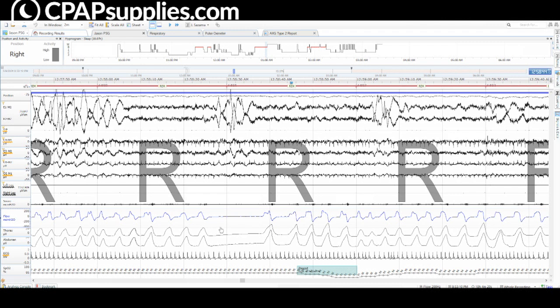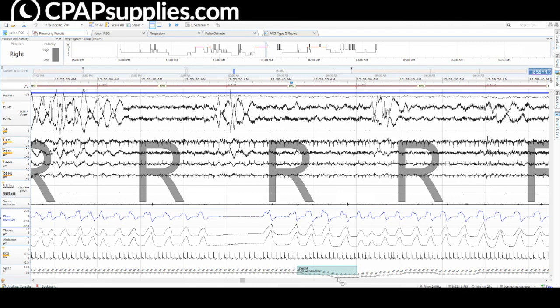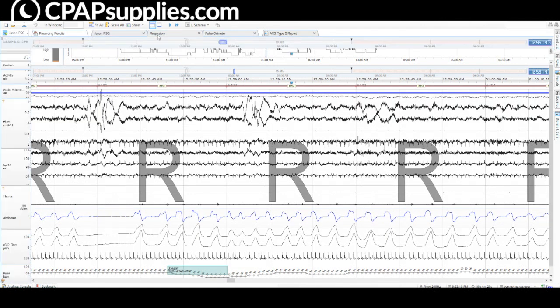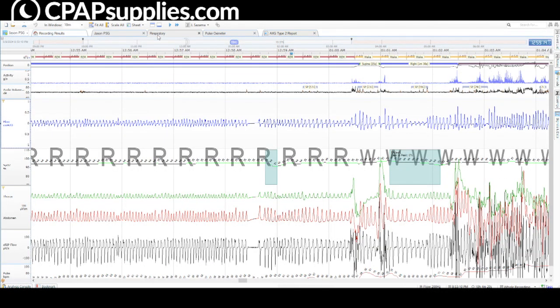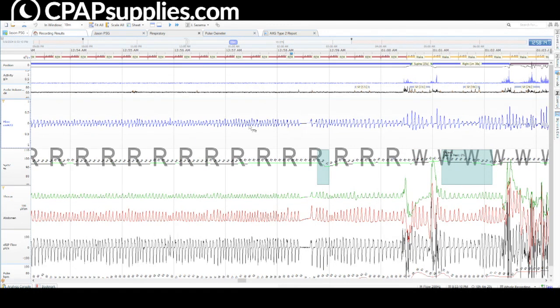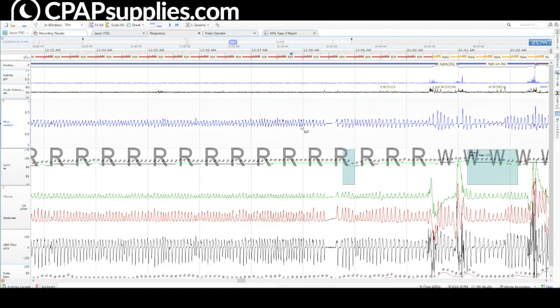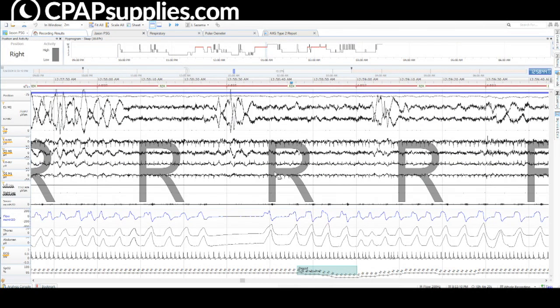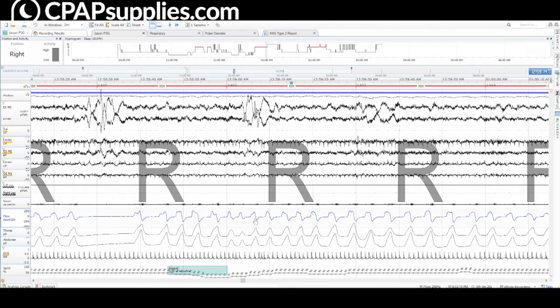Yeah, I probably should have scored it. But anytime you score them, all of a sudden, everyone's like, oh my God, they have central apneas? Most doctors know, like sleep doctors, that you're going to have transient central apneas in REM. And they usually tell you like, dude, just don't score them because otherwise everyone freaks out. And this is why there's really nothing to be seen. Yes, you're going to have a blood oxygen desaturation because of them. But really in the scope of things, if I zoom out again, it's like one in a sea of nothingness. So there's really nothing to worry about. Trust me, this is what they look like.